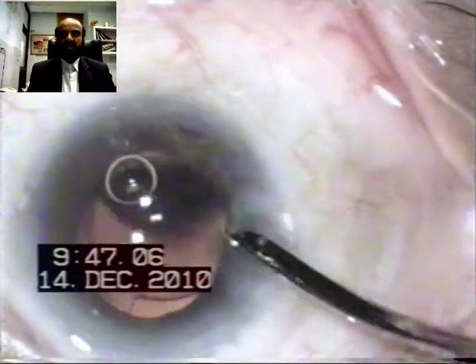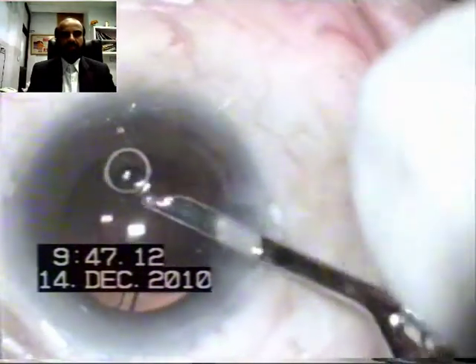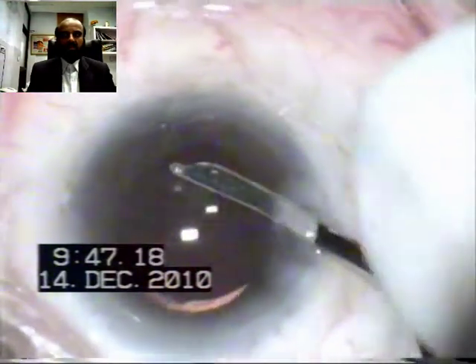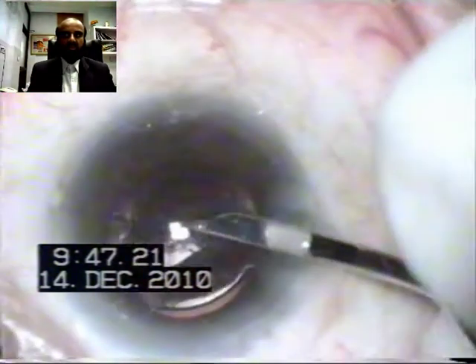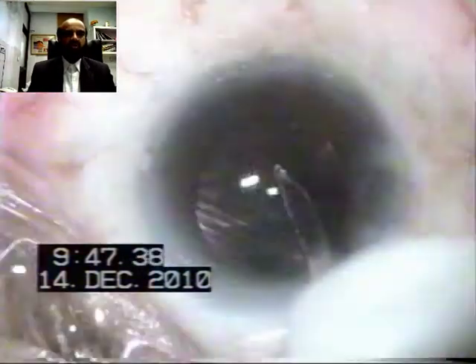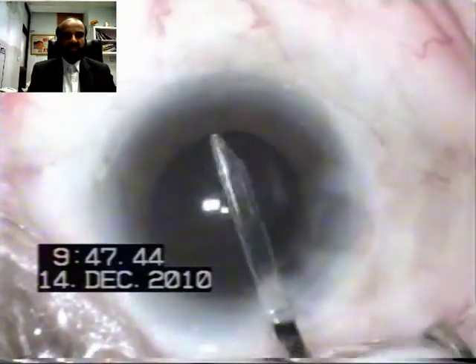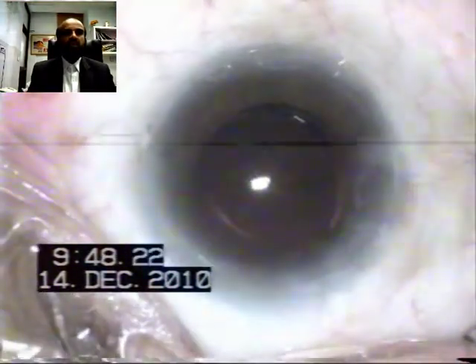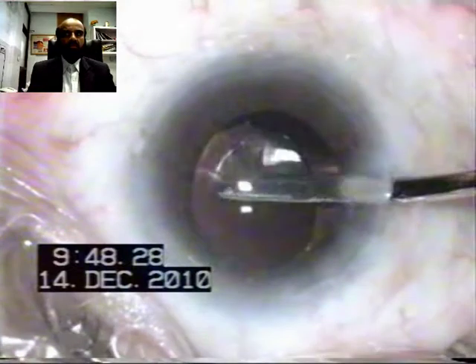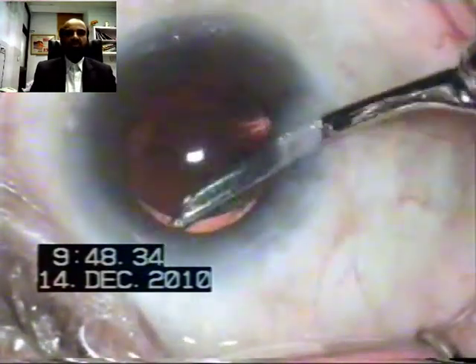Once the IOL goes in, the rest of the maneuvering can be very easily undertaken with the help of a Simco cannula. The haptics of the IOL are placed one by one inside the capsular bag. The viscoelastic is aspirated from in front of the IOL, and the irrigation aspiration cannula is taken behind the IOL haptic to clear the viscoelastic material.